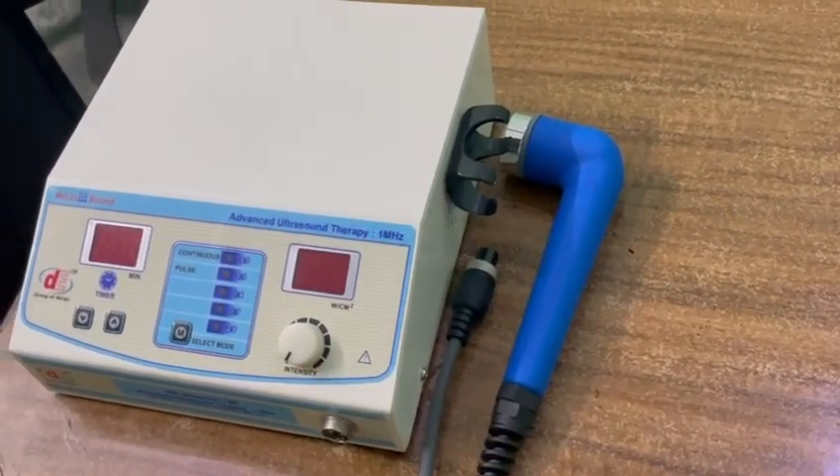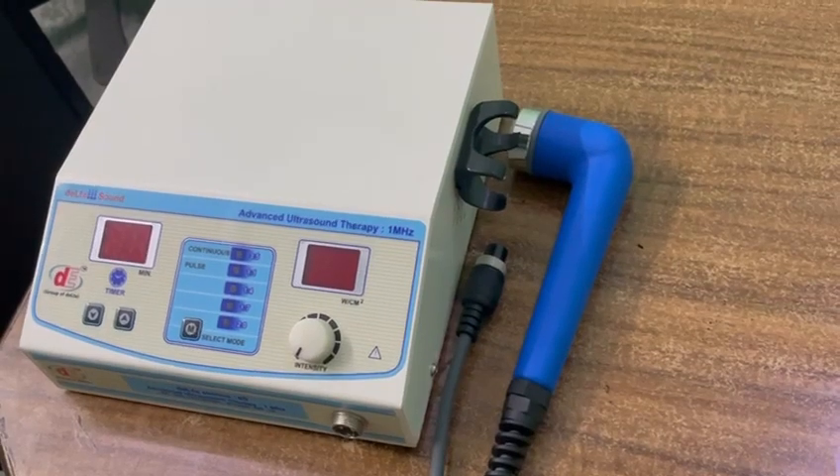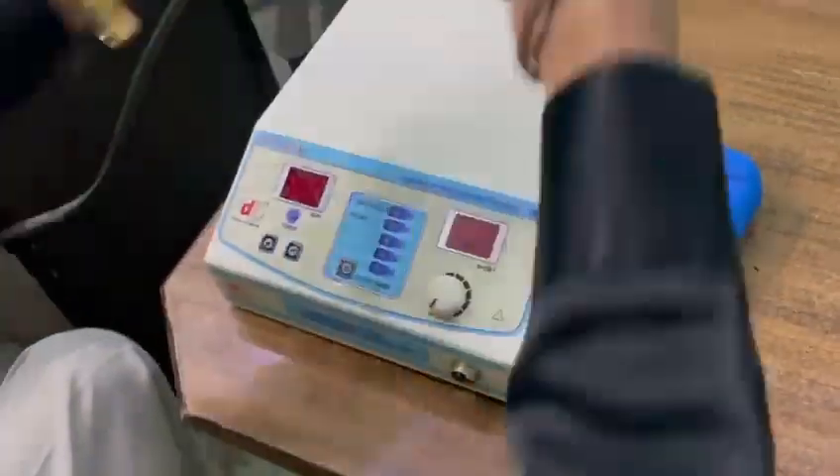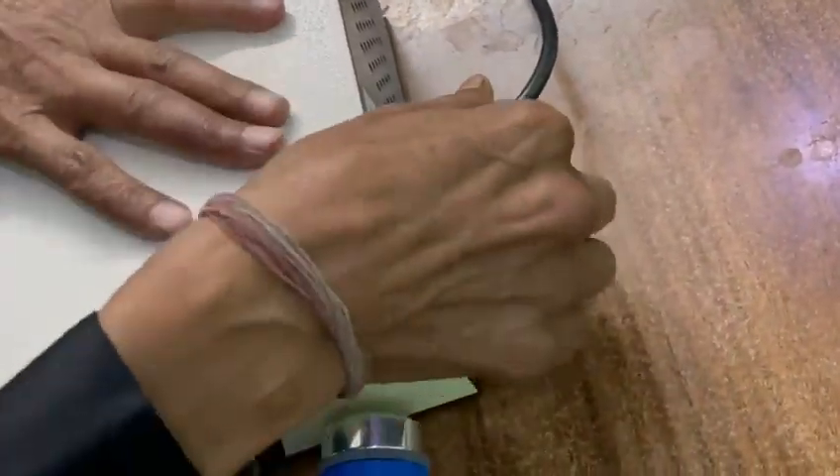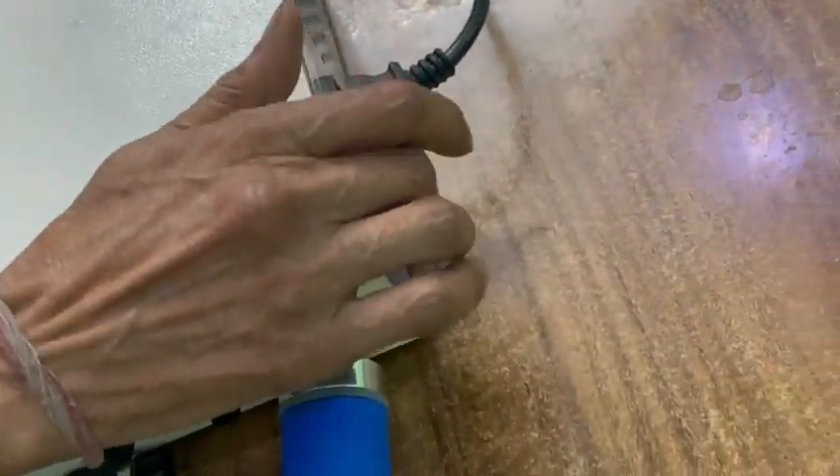This is 1 MHz ultrasound therapy — how to test the unit. Insert the power cable and switch on the unit.